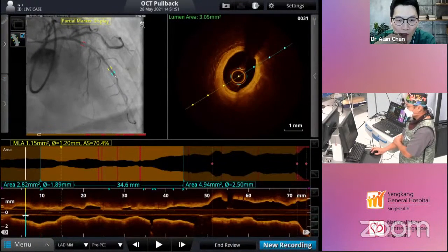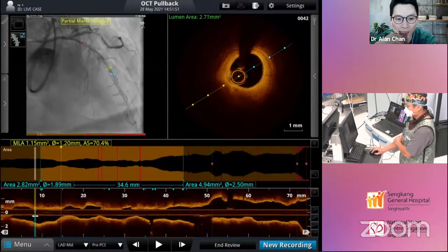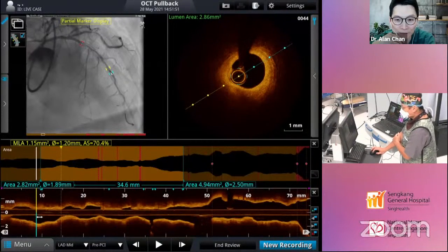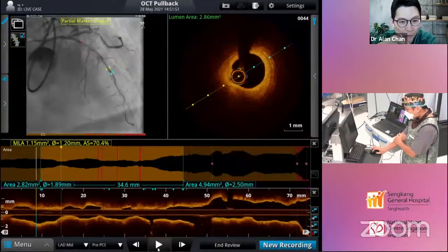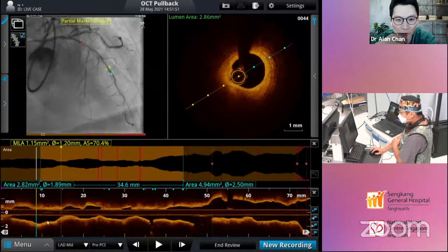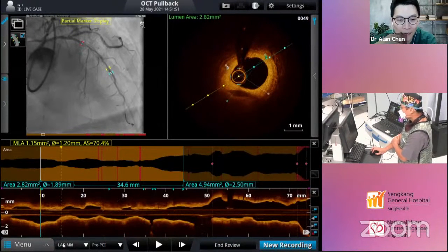So we try to avoid landing in moderate disease because these studies show this predicts edge restenosis. We also try to avoid calcified plaque, because it makes it difficult to dissect and makes the scenario difficult. So I think he already made a good spot. But if you're counting the EEL measurements, usually we need a regional assessment of the underlying EEL of at least more than 180 degrees. And for this, I think you need to use your judgment.